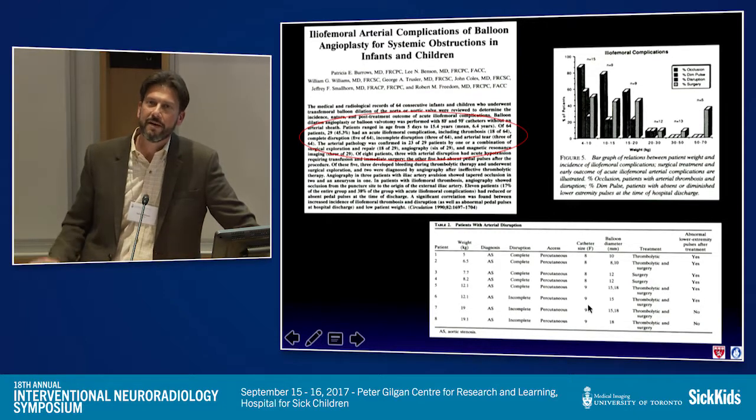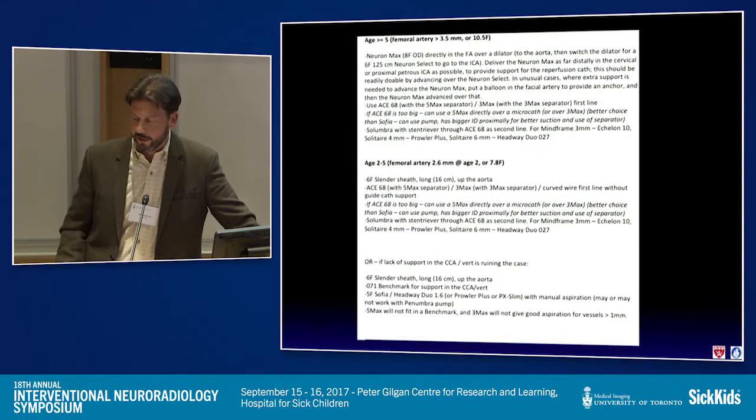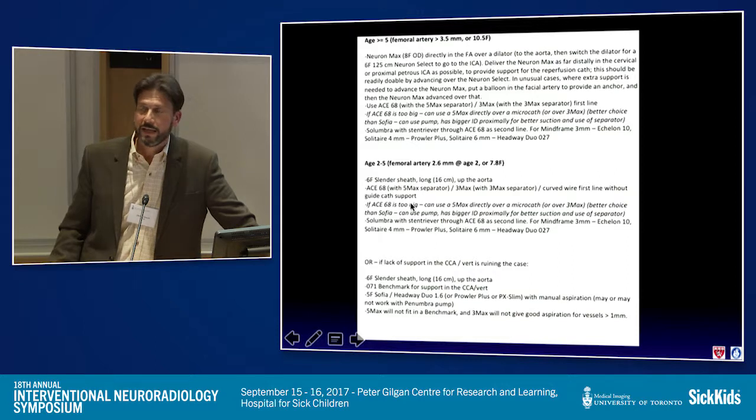So one does have to have an approach that is targeted towards age, mostly for access, not because of the intracranial issues. We do that, so we have an over age 5 protocol and an age 2 to 5 protocol. Most centers that I know that do any intracranial thrombectomy for children start at age 2. We've certainly never intervened at that young an age.